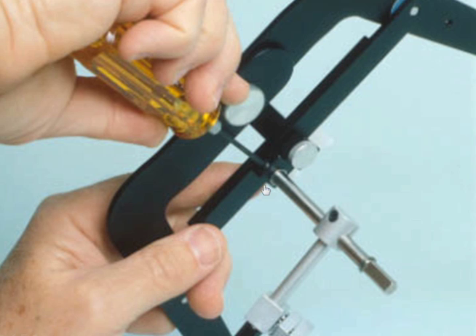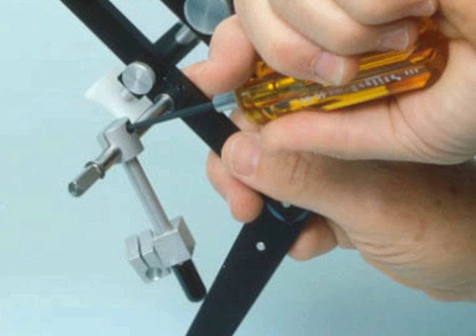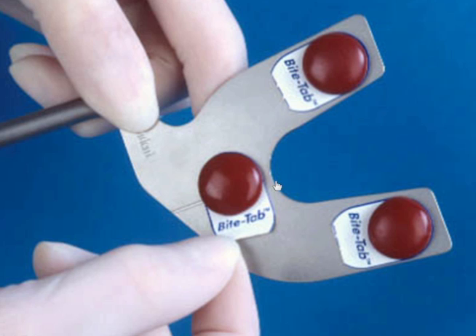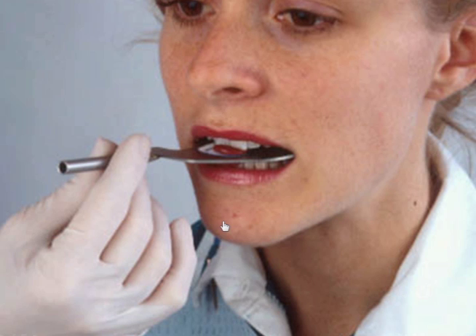We want to make sure that the double toggle clamp is loose as well as the single toggle clamp. We have the bite tabs, which is a red impression compound that's been put on a self-adhesive strip that we can peel right off the sheet of paper and stick onto the bite fork in the incisor area and then one in each molar area. You can also see that there's a little mark here on the bite fork which will correspond to the patient's dental midline. We can temper this in hot tap water, and then we can come to the patient, getting an indentation of the upper teeth into the compound.